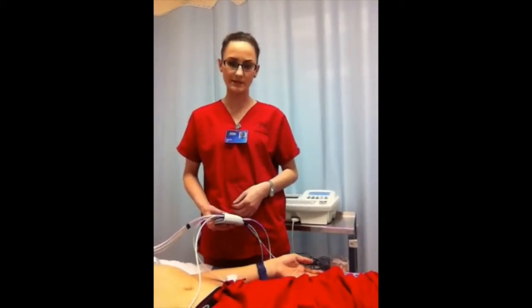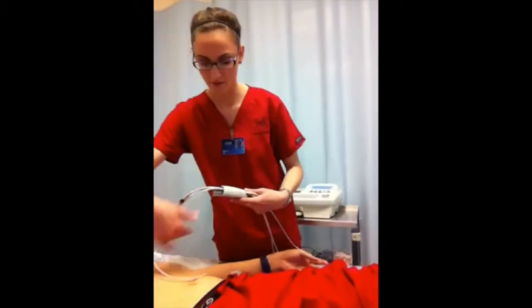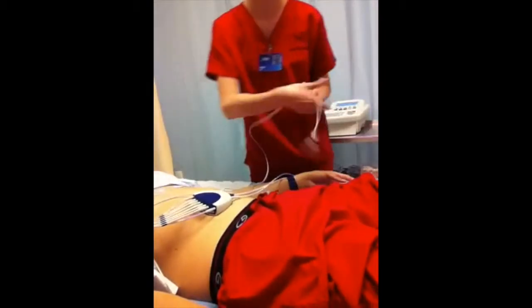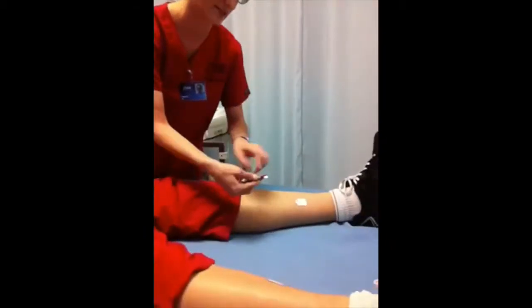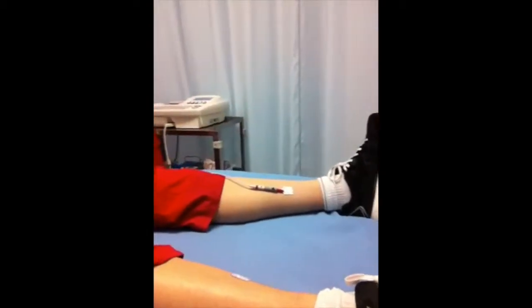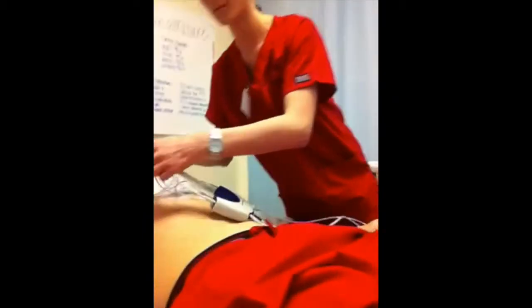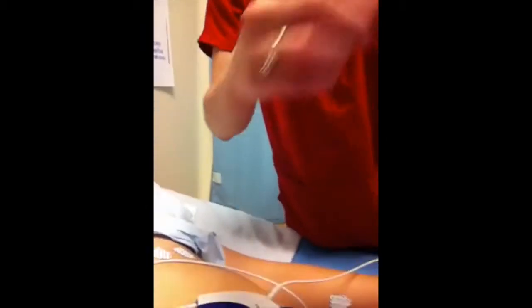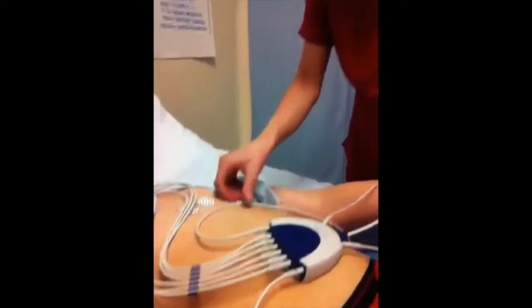Get the machine ready and turn it on by pressing the green power button. Place the leads above the patient's pelvic area and start applying them to the electrodes. This one is the left leg — make sure that the red part of the lead is facing up and put it on the tab. This is the right leg, and then start applying them to the arms: this is the right arm, and then the left arm.